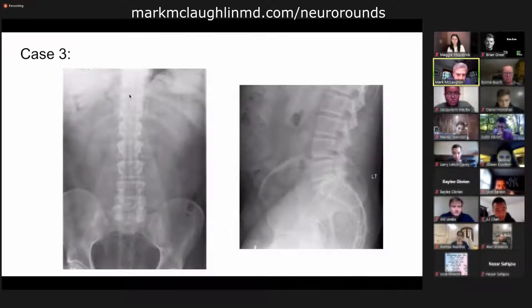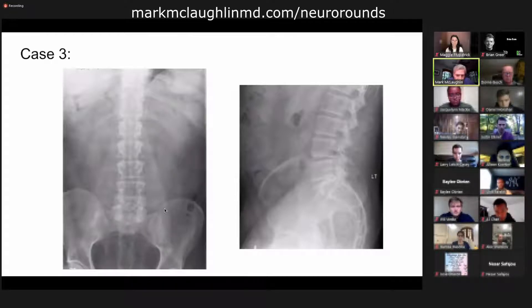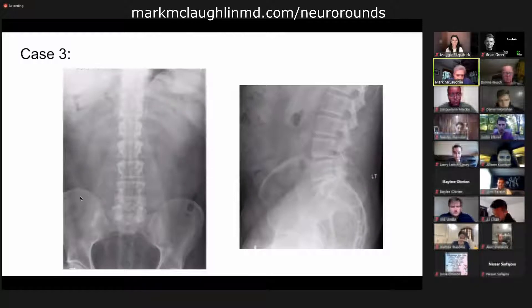I want to see what's the alignment in the coronal plane. Is there any coronal imbalance? The answer is no — this person has a nice straight spine. Are the iliac crests lined up? We hit iliac crest here, iliac crest here. Is this line equal? No, it's a little tilted. Could that be related to spinal irritation or some sort of pain? Yes, that's possible.